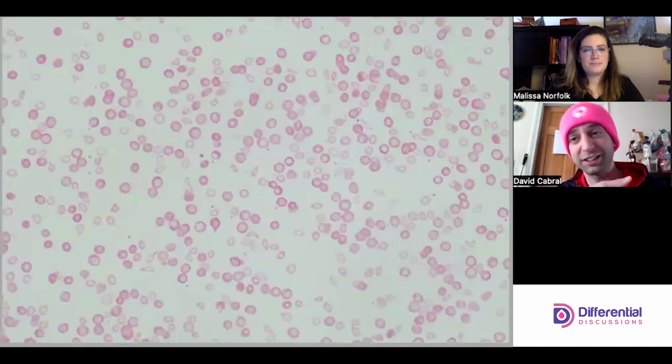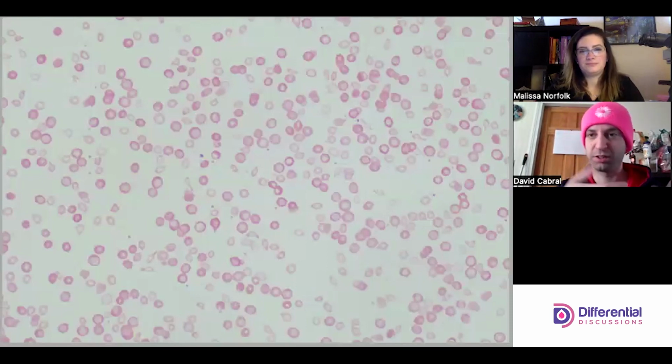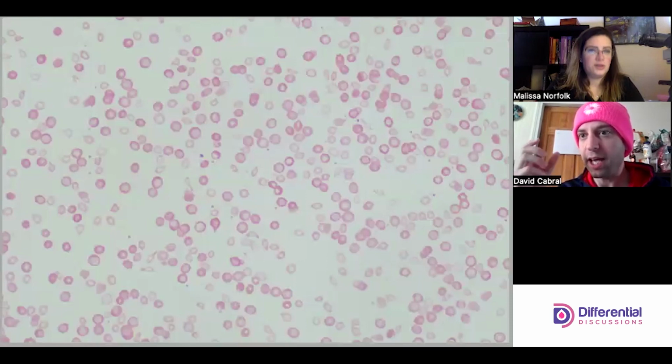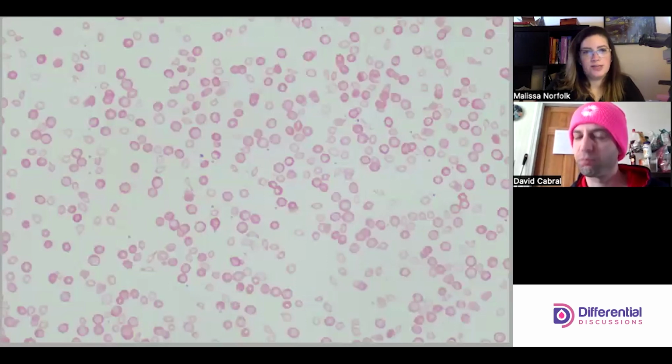I hadn't seen this slide at all, in truth, before. About 5 minutes ago we just peeked at it, and Melissa wanted to do this video on a dimorphic population, and it caught me off guard how in my face it was. I know I've seen dimorphic populations in the data set, and on the slide it's maybe not quite as in your face as this. So how do you see it in the data set? What do you see?